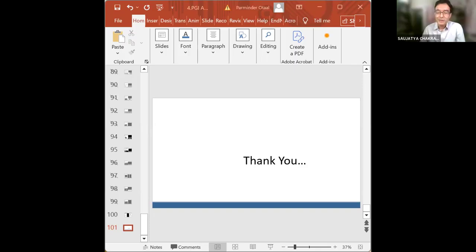Sir took the time out to show the videos of how to select and acquire. I think that's really nice because we can do it. Most of us don't know that we have these things available with us. We can do it in our software, which is available in our CT machines. The point is just to start doing it. Once we get into it, we will really love to do that.